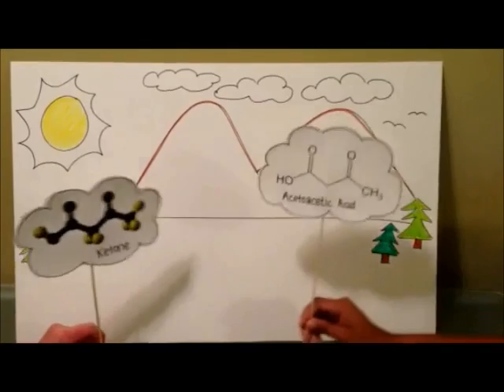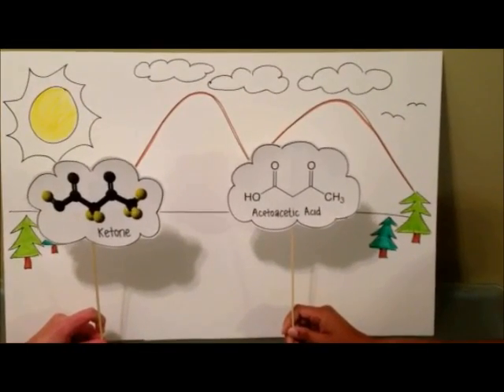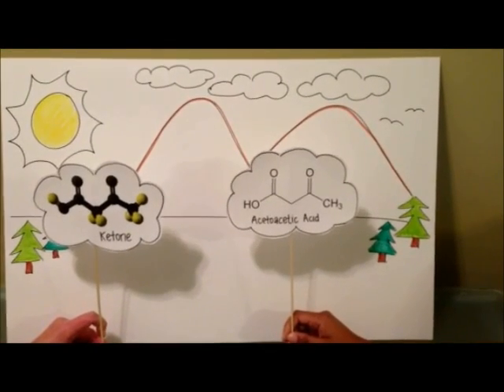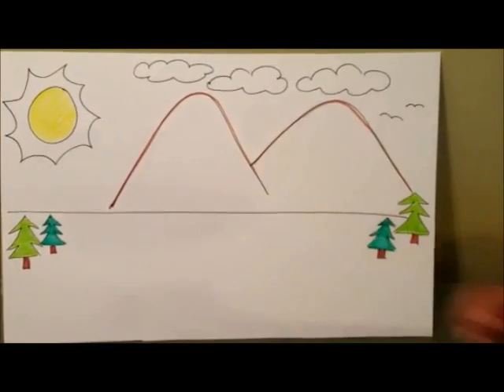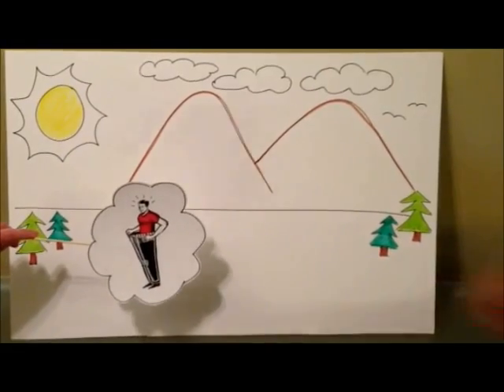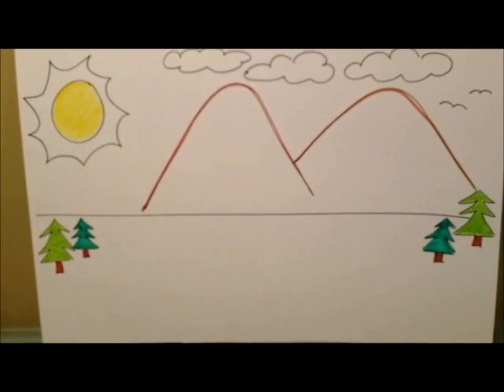Ketostix measure the amount of ketones in your urine. A ketone is a substance which is not usually harmful when found in small amounts in the urine. The amounts found in our urine can give us information on carbohydrate and fat metabolism. Patients who commonly test for ketones are dieting patients, pregnant patients, or diabetics.